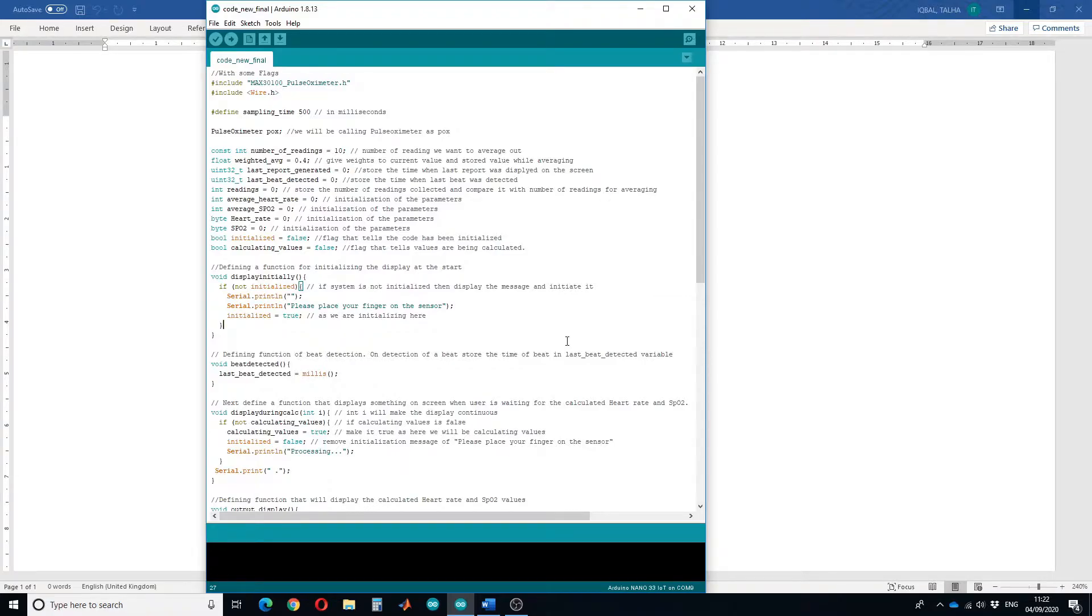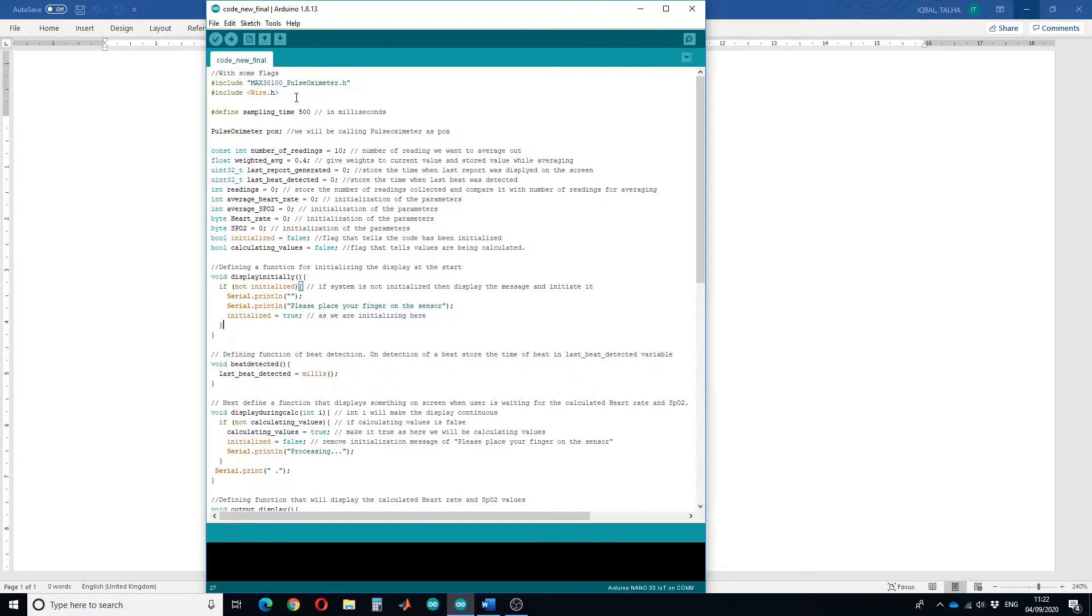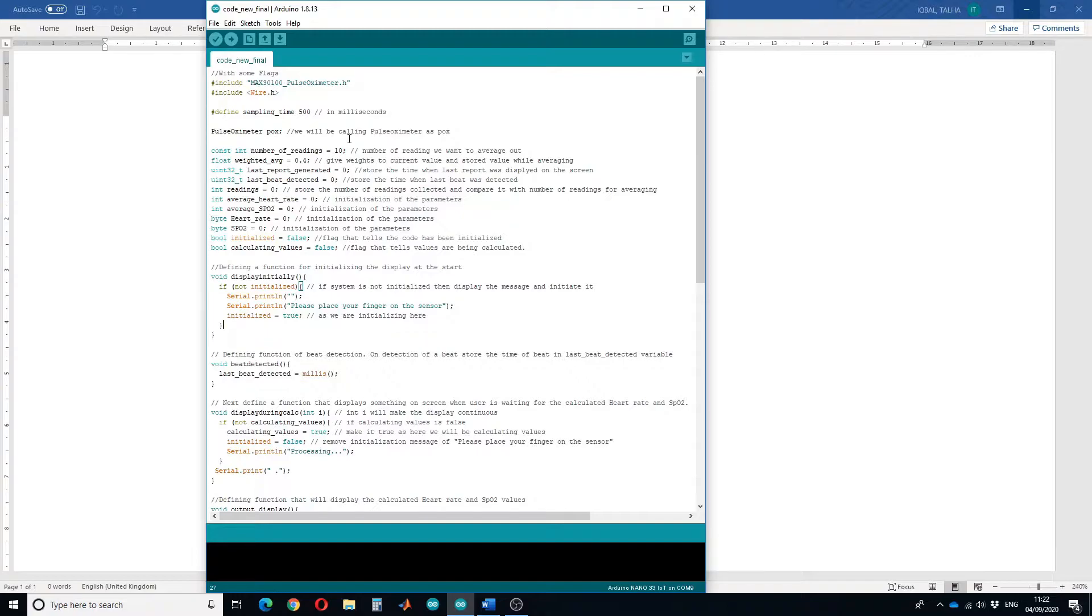First let us see the code. First of all I have included MAX30100 pulse oximeter and Wire library, then I have defined a sampling rate of 500 which is in milliseconds, and then defined pulse oximeter as an object and we will be calling pulse oximeter as POX.